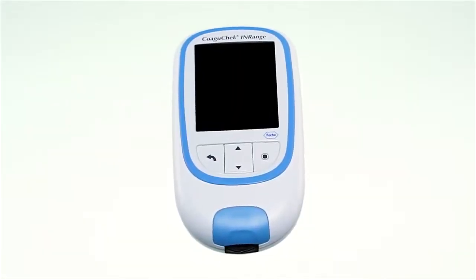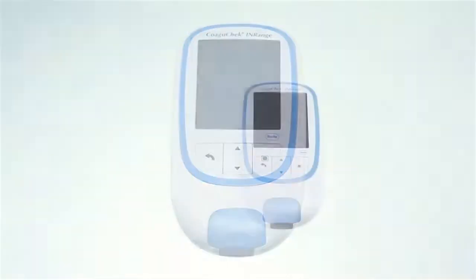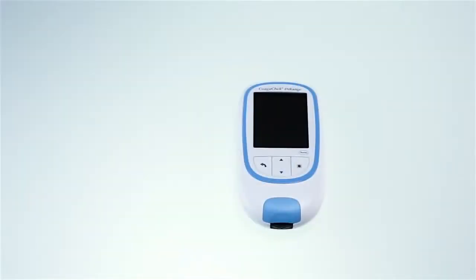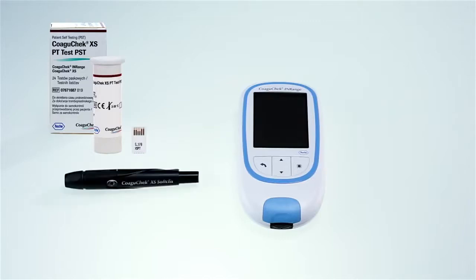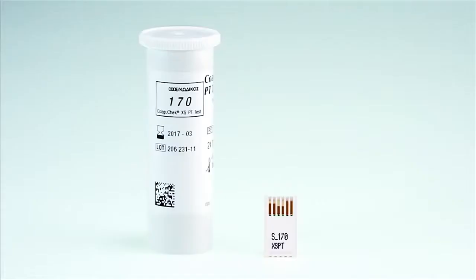Next we will show you how to test your INR. The first thing to do is to make sure you have everything you need to perform a test: a COAGUCHECK INRANGE meter, a container of COAGUCHECK XS PT test PST strips and a code chip, a COAGUCHECK XS soft clicks lancing device, and a COAGUCHECK soft clicks lancet. A lint free cloth or paper tissue. Have the test strip container at hand.